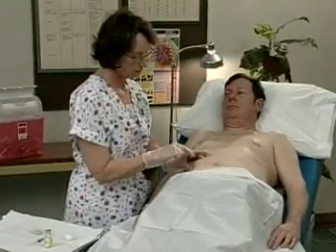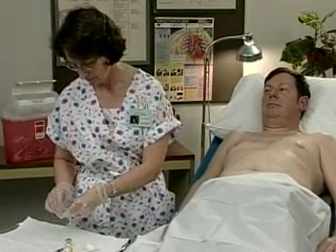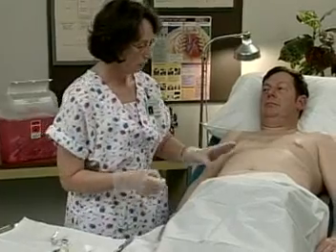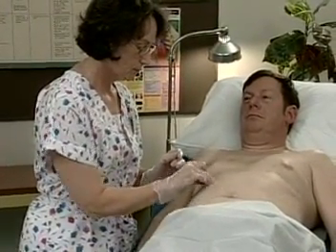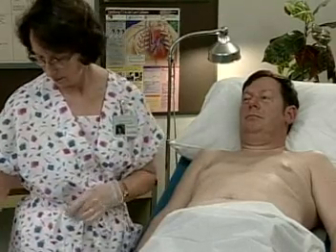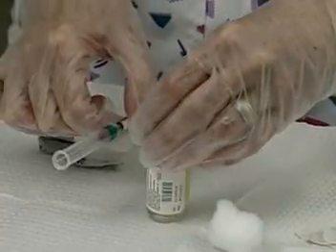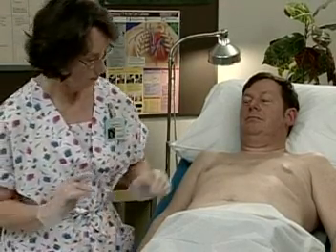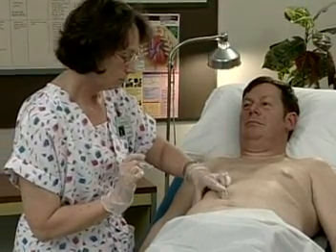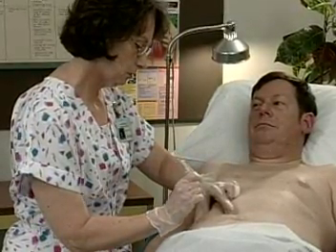Locate the site. Clean with alcohol. This might be a little cold. I'm going to clean it off first. Allow to dry. Pinch the tissue. Okay, you're going to feel a sharp little prick.